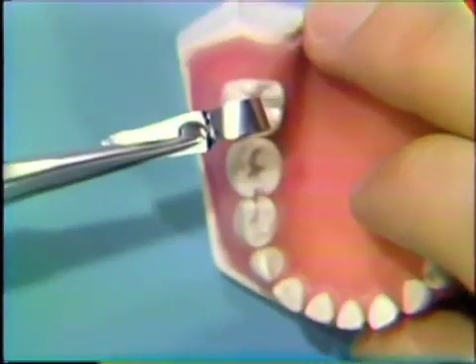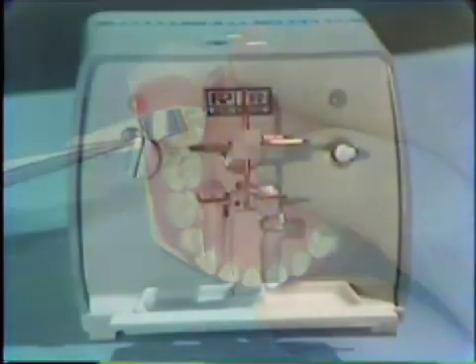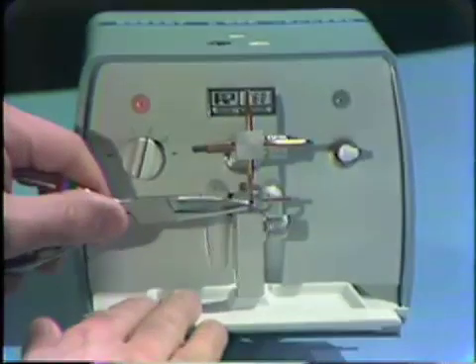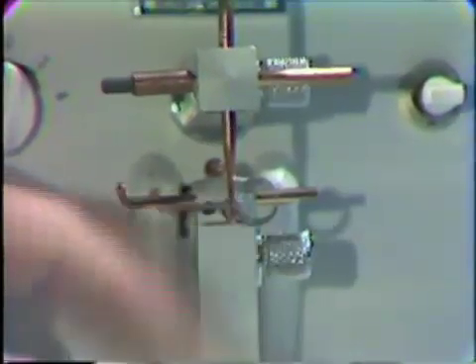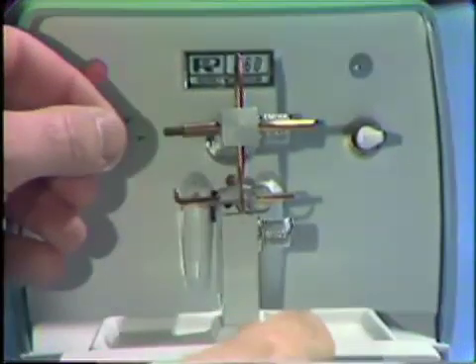Now the band is ready to be welded. We'll carry the band back to the spot welder, maintaining the band in the hull pliers just as we've taken it off the tooth. We're going to make the weld right at the crimp, at the corner where we have crimped the band. We'll weld in two places — one at the occlusal and one at the cervical.